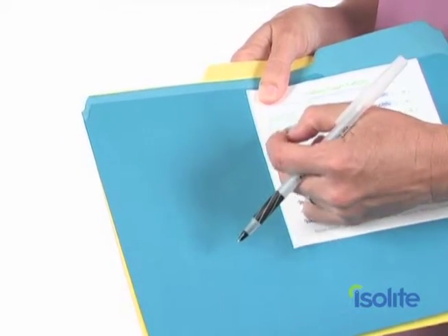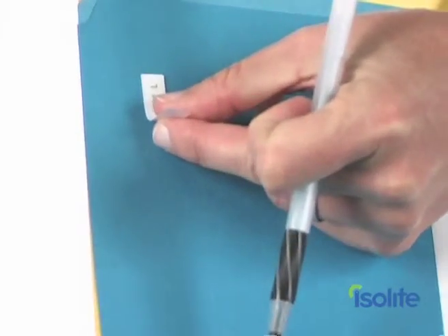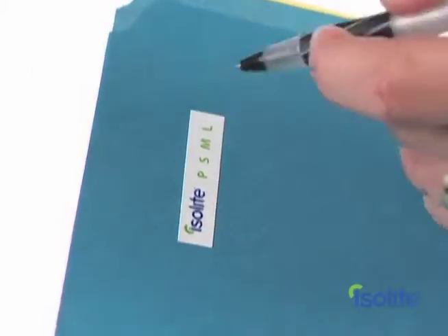You'll want to use the chart labels provided with your system to record mouthpiece size in the patient's chart. That way you'll only have to size them once and your assistant will always have the setup ready.